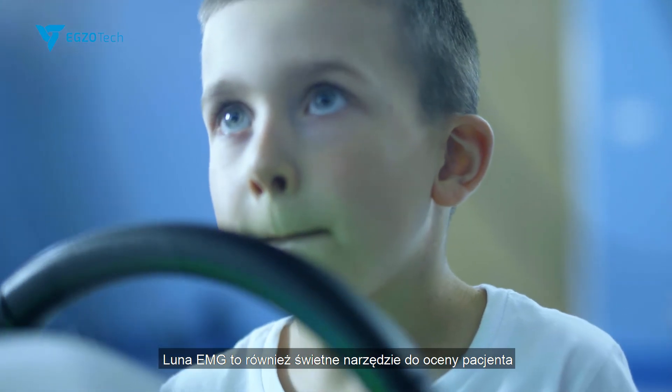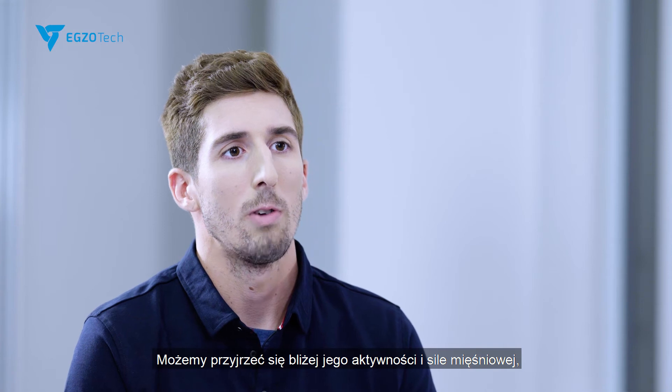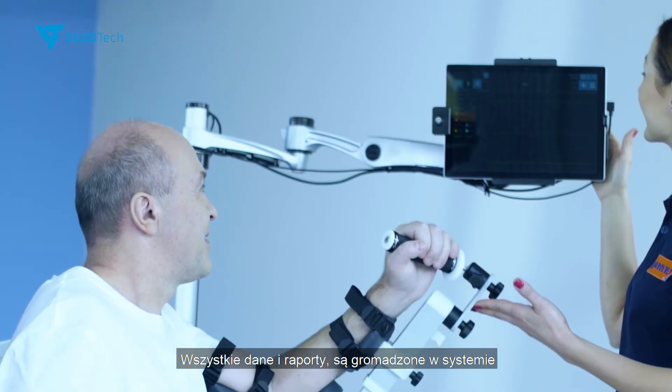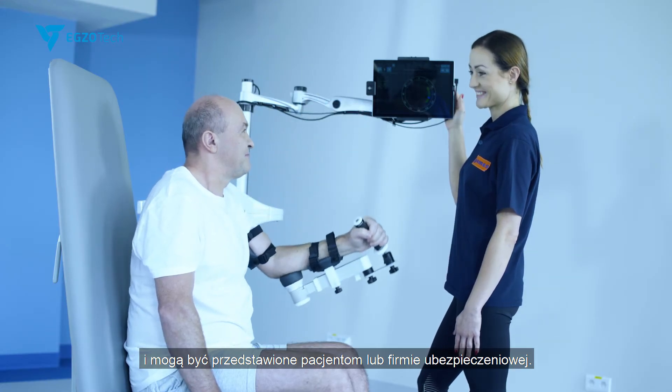Luna EMG is also a great assessment tool. We can get a closer look into the muscle activity, muscle strength, proprioception, and spasticity of the patient. All data and reports are stored in the system and can be presented to the patients themselves or to insurance companies.